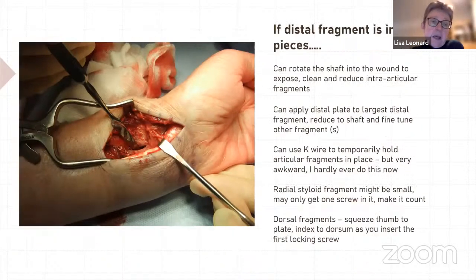Other tricks: if the fracture is in a lot of pieces, you can rotate the shaft out of the wound and then you can get in to see the fracture from the inside up into the joint. You can't take the ligaments off on the volar side. That's a really good little trick, and you can wash and clean and use, sometimes, a little retractor, like a skin hook even, can be enough to just fiddle around with your fracture fragments.